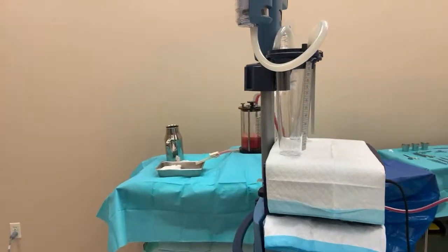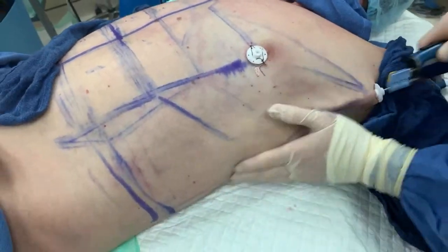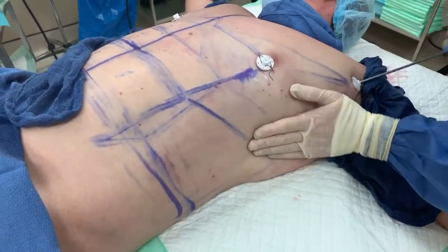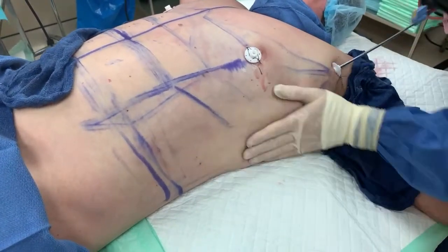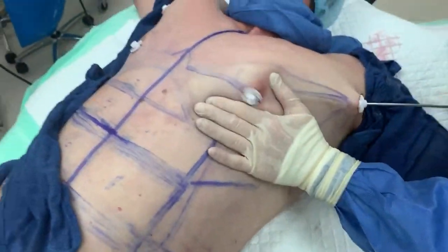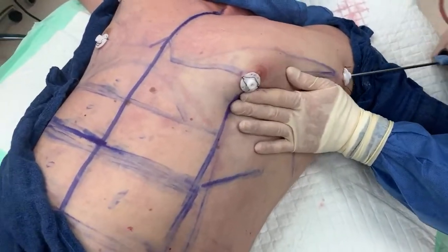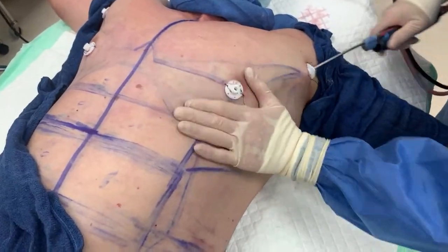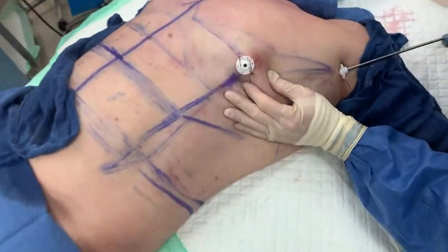You can kind of see the difference already — see the difference between this side and this side? Kind of see the difference. Now I'm digging this out — big tail here. I'm going to dig into the space here and I know where I am. I know the nerves, I know the blood vessels. Doctors who badmouth me — 'oh, he goes through the armpits, his nerves' — it's obviously ignorance.